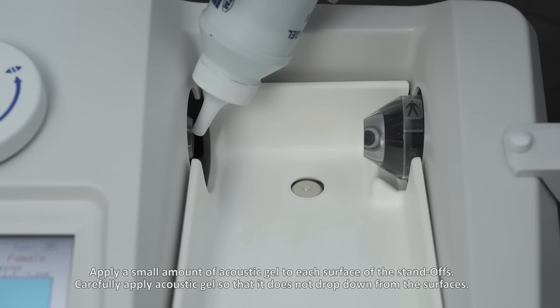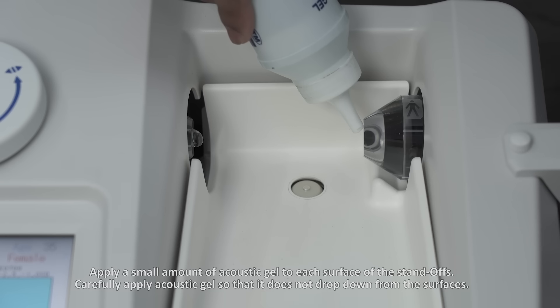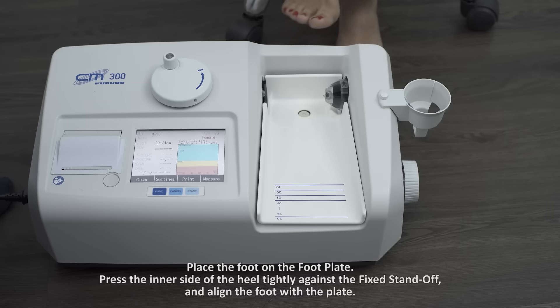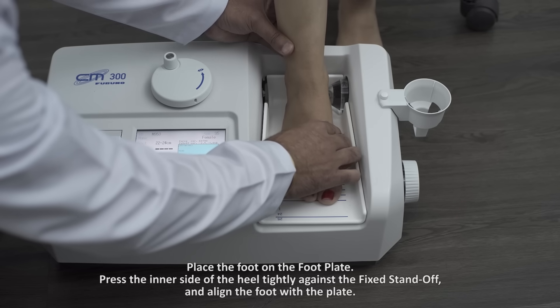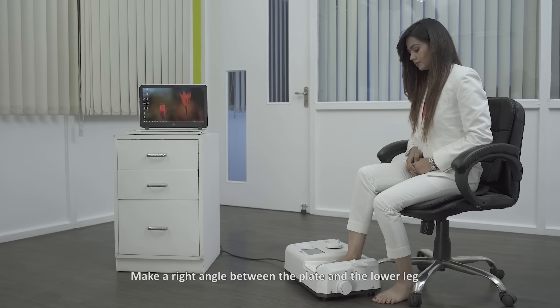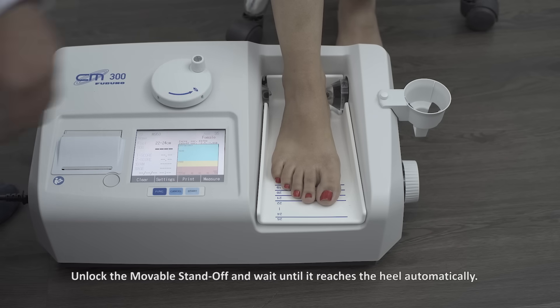Apply a small amount of acoustic gel to each surface of the standoffs. Carefully apply the gel so that it does not drip down from the surfaces. Place the foot on the footplate, press the inner side of the heel tightly against the fixed standoff, and align the foot with the plate. Make a right angle between the plate and the lower leg. Unlock the moveable standoff and wait until it reaches the heel automatically.